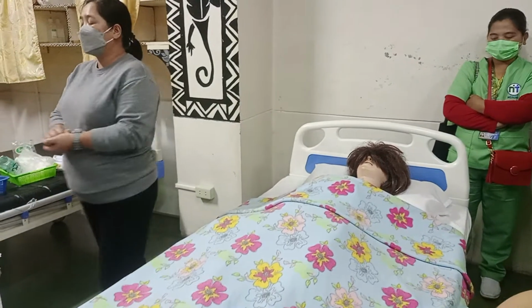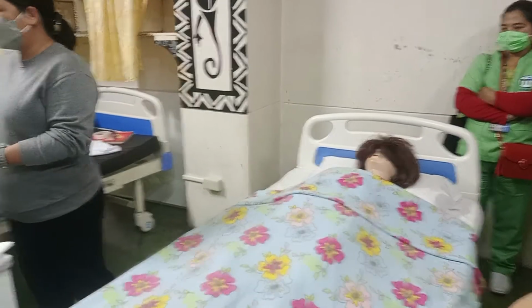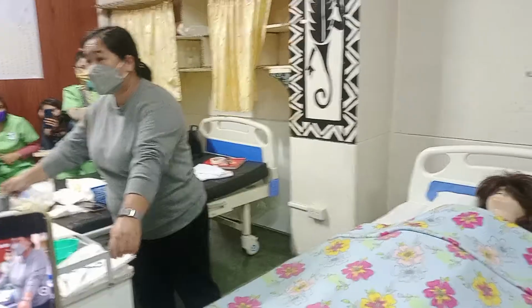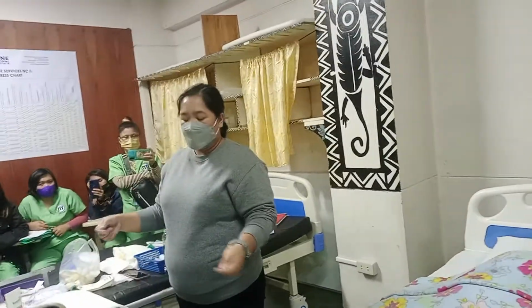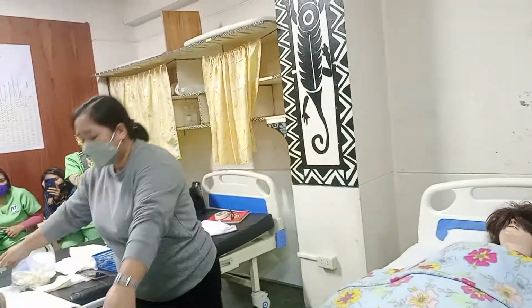Okay, I will go out, I will wash my hands, and prepare the procedure. Naka-cart kang papasok or nakalagay siya sa tray. Okay, and then ilalagay mo sa table ng patient.